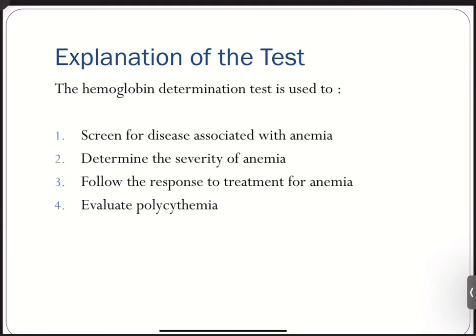Okay. Your hemoglobin is being used to screen for diseases, especially those associated with anemia. Okay, this also reflects the severity of your anemia. Okay, this can also be used to follow up the response to the treatment for anemia, especially for patients who are on medication for anemia. Okay? Check natin kung okay na ba yung hemoglobin content ng mga patient natin. Okay? This can also evaluate polycythemia in patients.